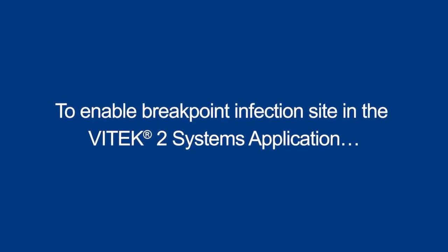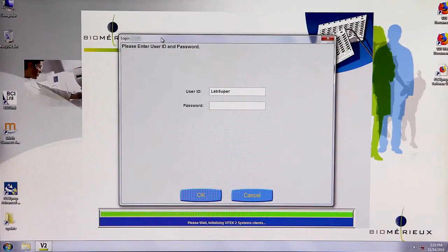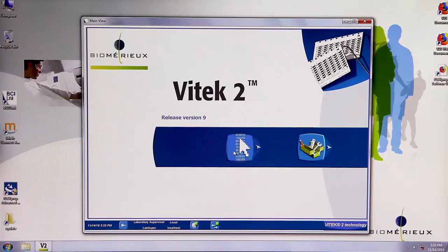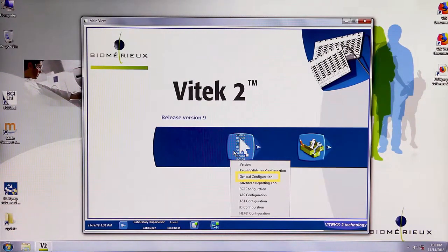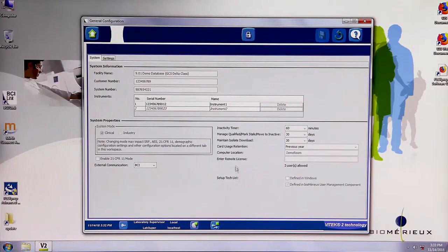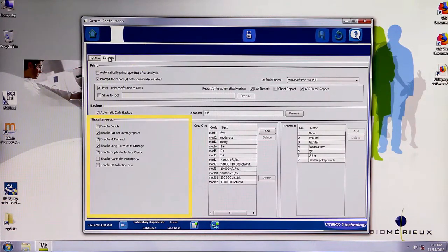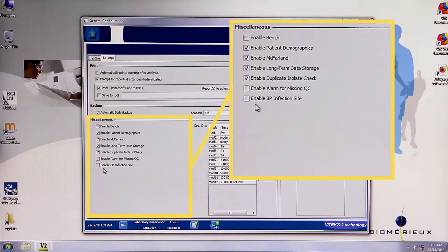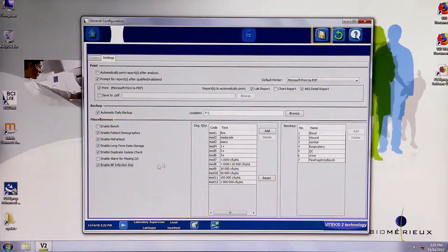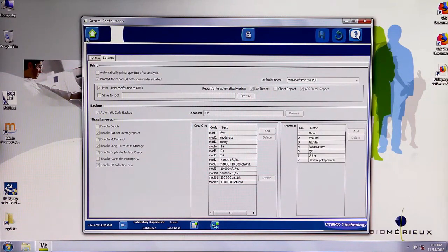To enable breakpoint infection site in the Vitec2 systems application, log in as a user with supervisor level access. Navigate to the configuration menu and select general configuration. Unlock the general configuration screen and click on the settings tab. In the bottom left section of the screen, check the box next to enable breakpoint infection site. Click the save icon and then the lock/unlock icon to lock the general configuration screen.